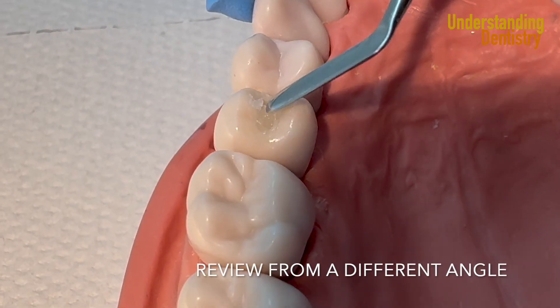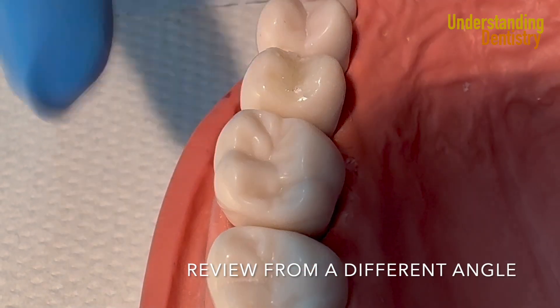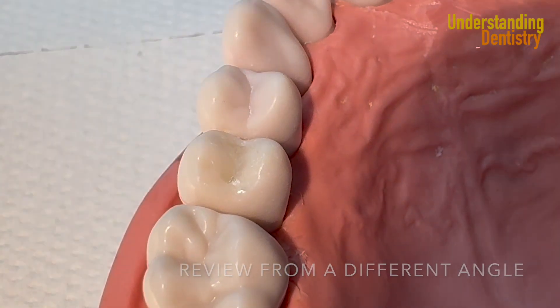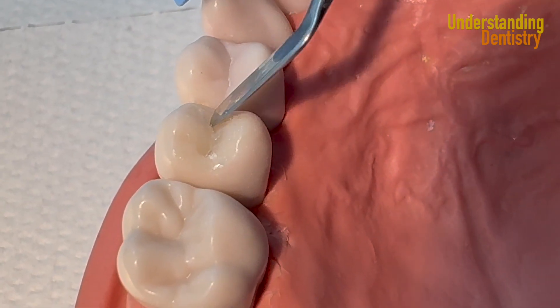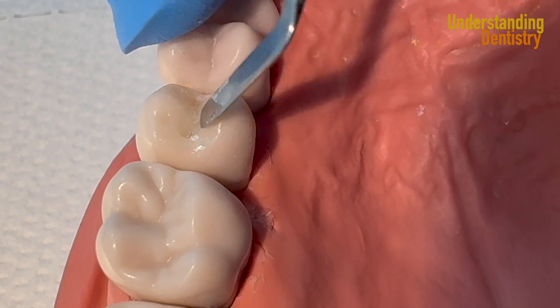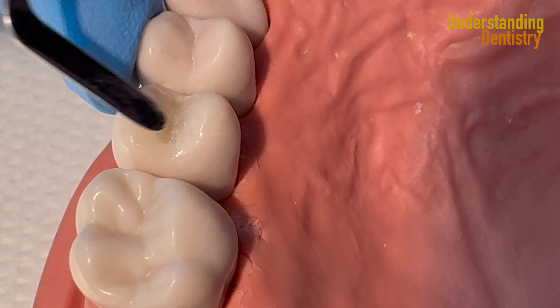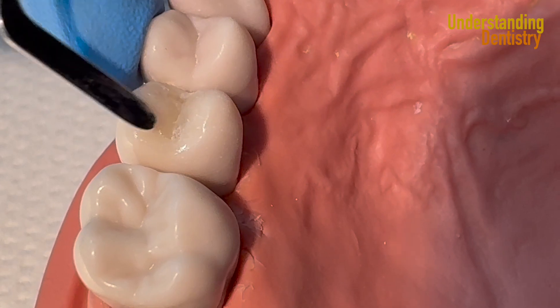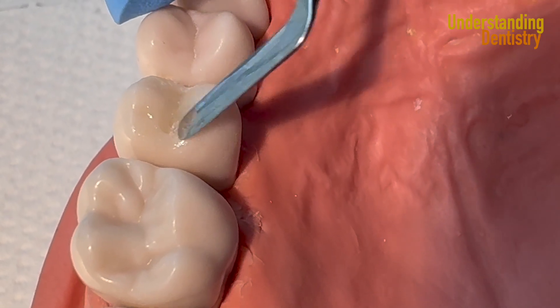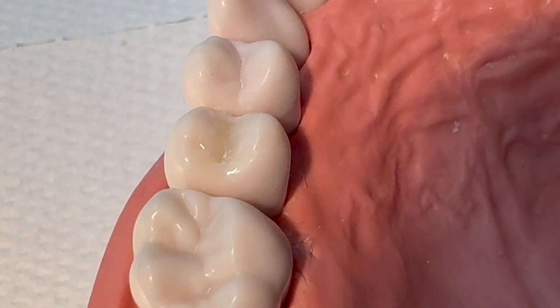Let's review this from a different angle. With the tip of the instrument you can create the sulcus or the fissures — you'll do this better as your learning curve develops. You can create the fissure in the middle with the tip of your instrument because the rest of the instrument is parallel to the surface.